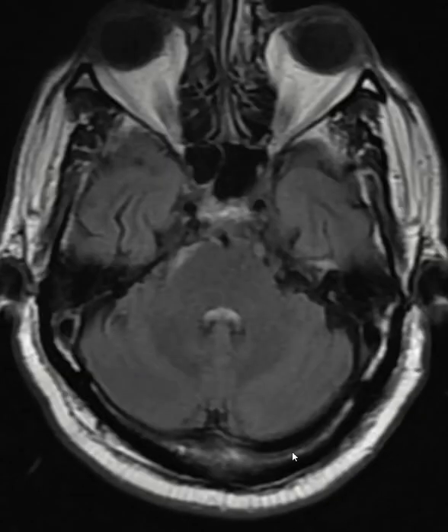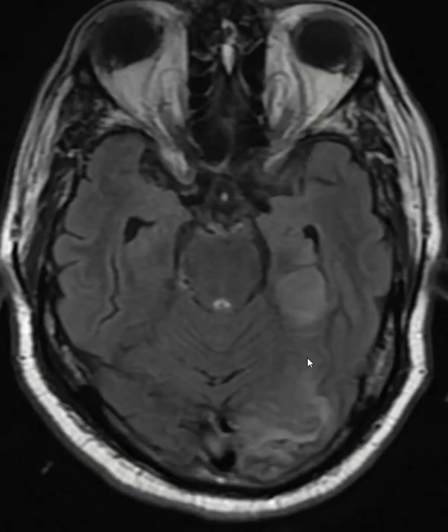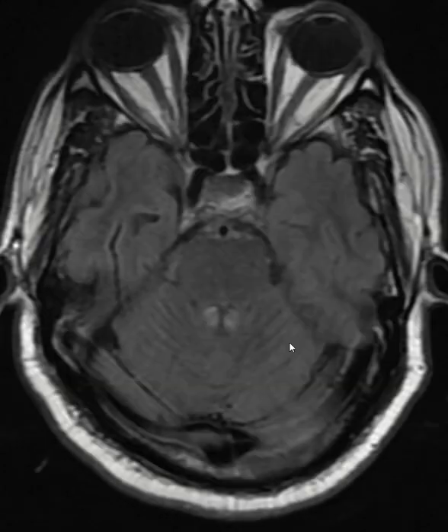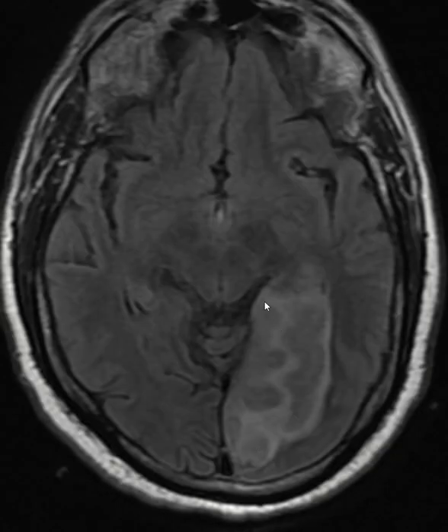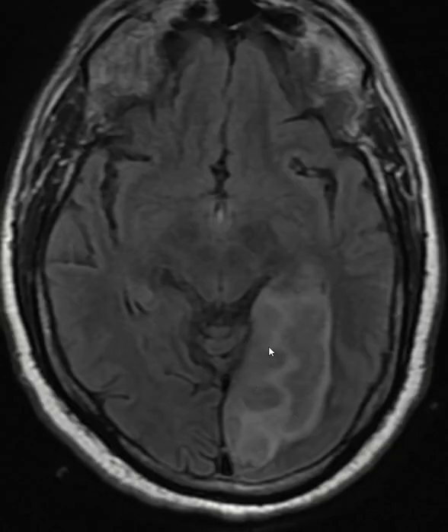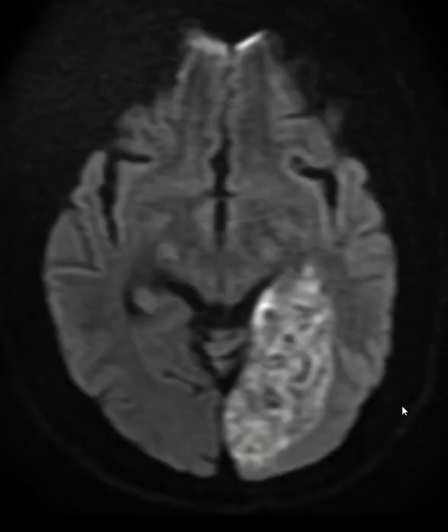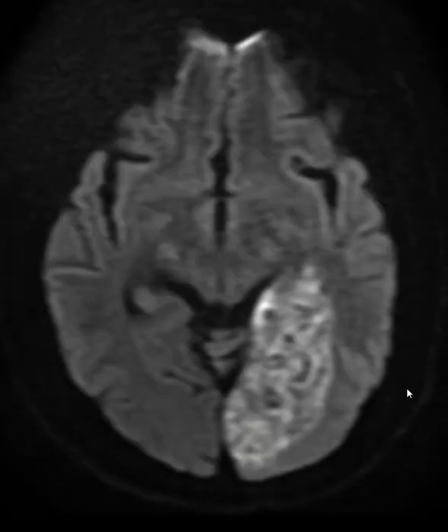Finally, to see the ADC map and note whether it is a true diffusion restriction or not — I want to point out that in this case, because of the hemorrhage, ADC values can go haywire. So don't really rely on that.